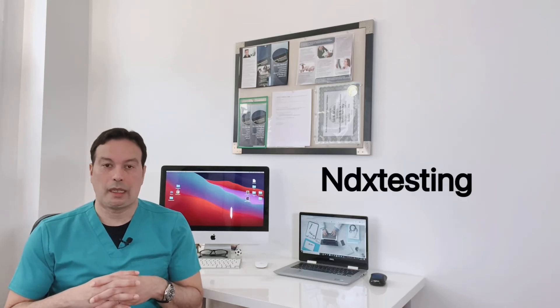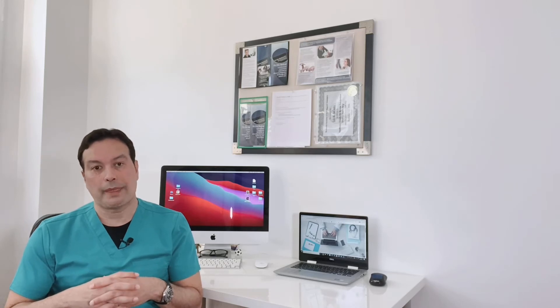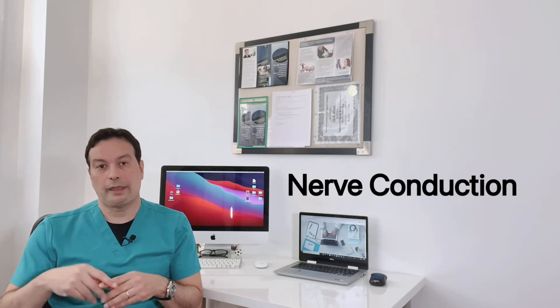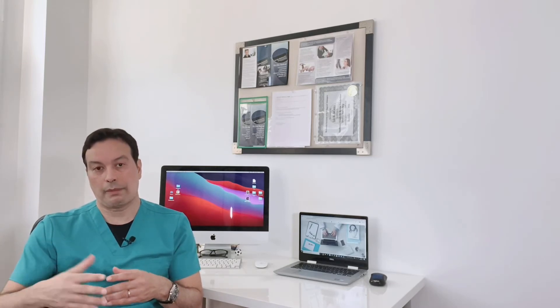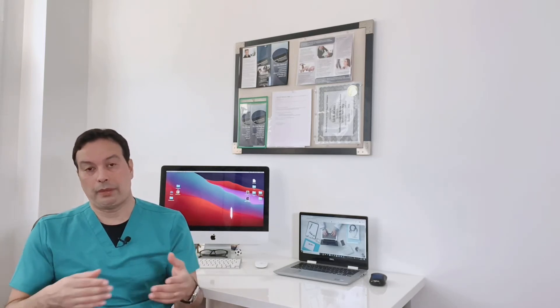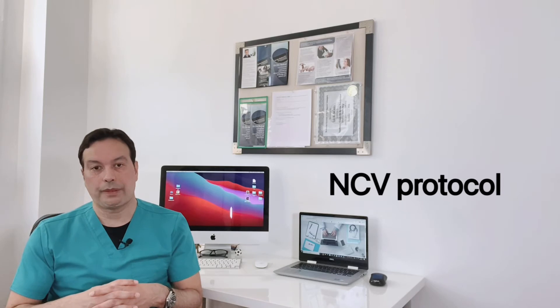Hi, this is Louis from ndxtexting.com. This video is for beginner technicians who want to learn about nerve conduction studies. We're going to discuss the lower extremities nerve conduction study protocol. If you're at the beginner stages and want to learn about nerve examinations, or perhaps you're a patient wanting to know about the NCV protocol, this video might be for you. Let's get started.